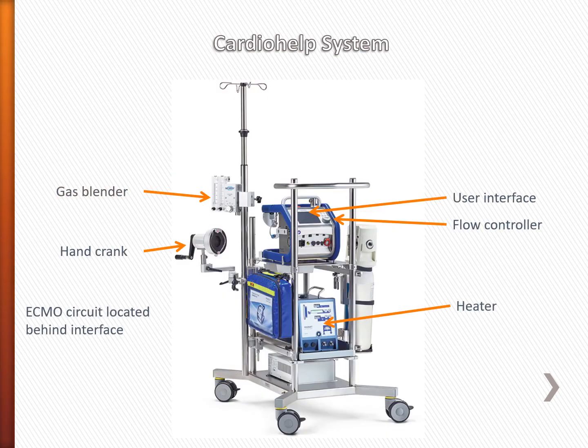This is our CardioHelp system. This is the integrated circuit, which is great for mobilizing patients as well as transporting patients. Although it looks different from the last circuit I showed you, it has all the same components.